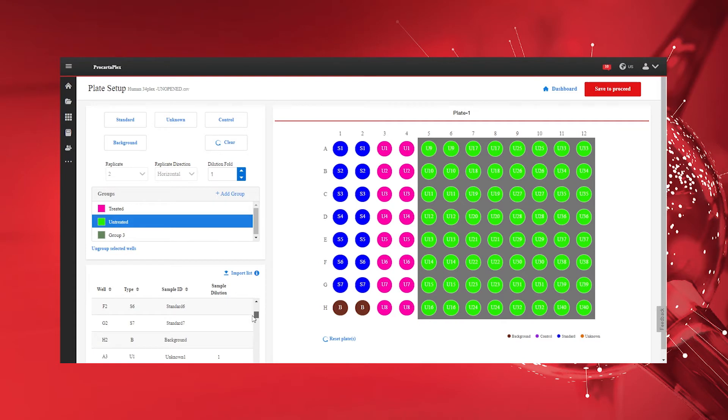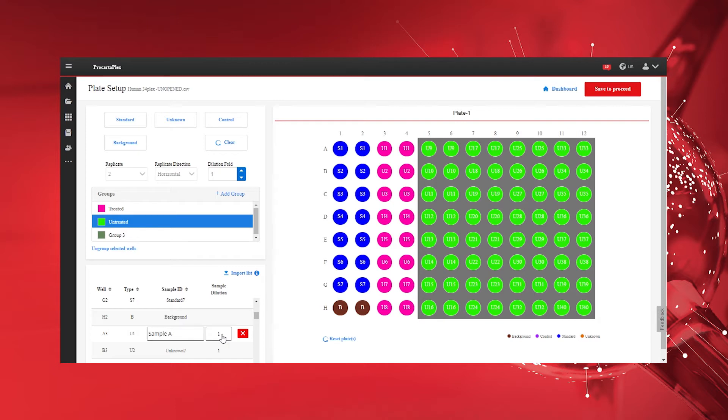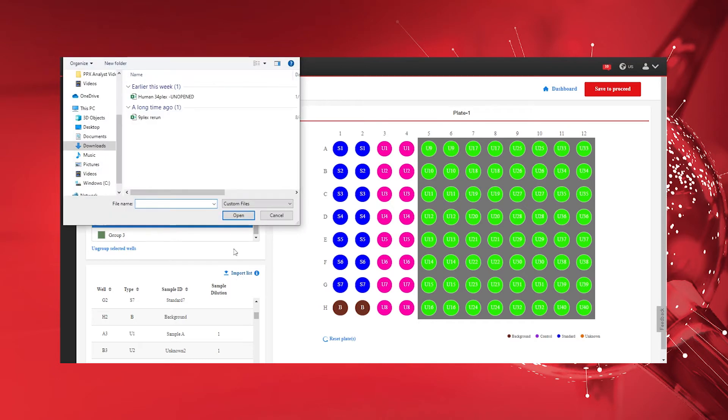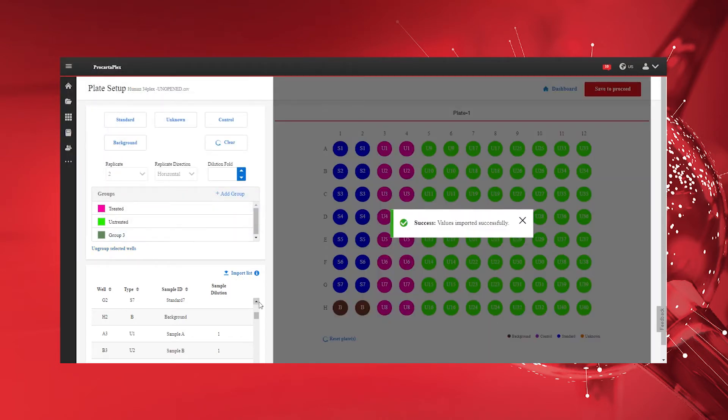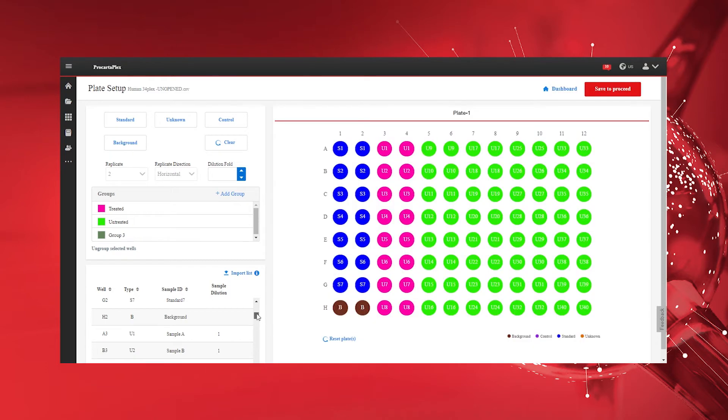Manually edit sample IDs of unknowns and add sample dilution factors by clicking on the respective form in the list. The ProCartaPlex Analysis app also supports import of sample lists in CSV and text formats to automatically rename sample IDs and include sample dilution factors.